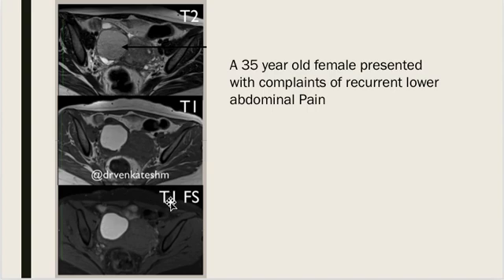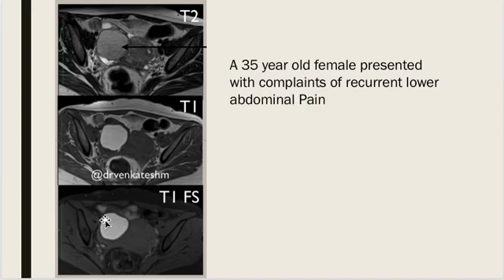Coming to the T1 fat saturation image, you can see the abdominal fat is suppressed. The peritoneal fat and omental fat are suppressed, and the lesion still looks bright, indicating that it contains a blood product. So based on the T2, T1 fat saturation, and T1 weighted characteristics, this is a classic case of endometrioma.